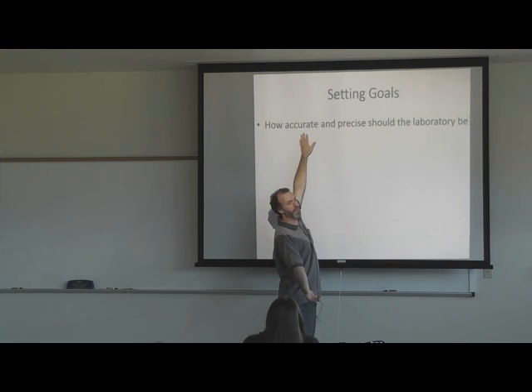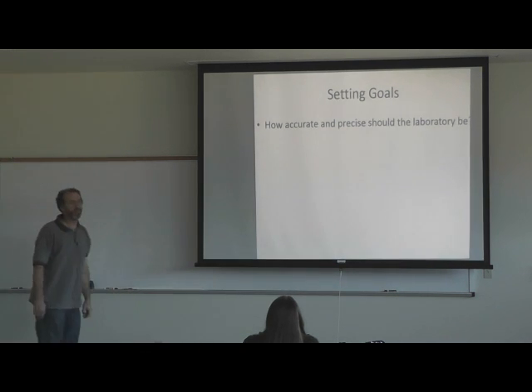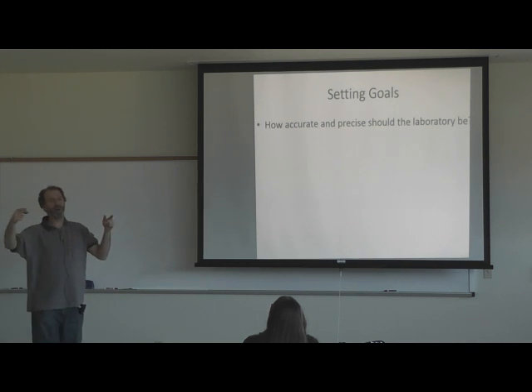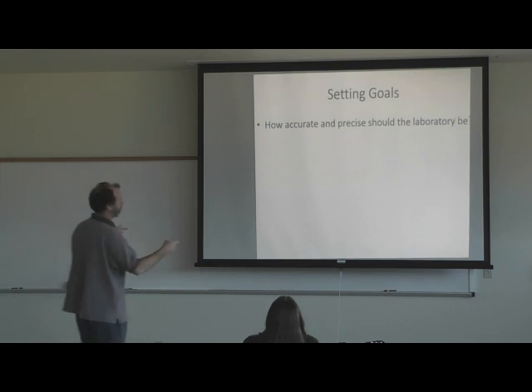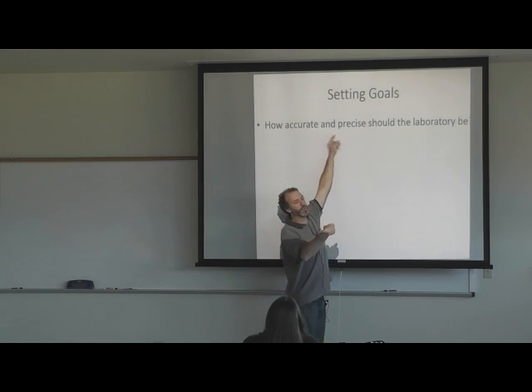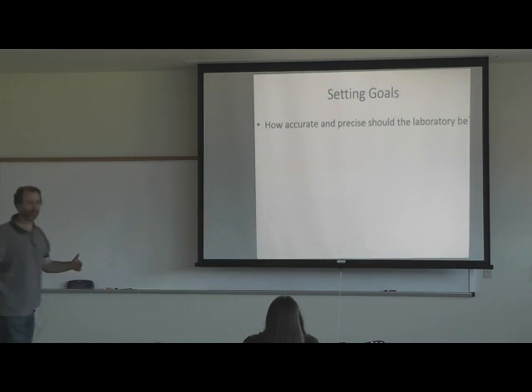What does that tell you, the accuracy? Do you know that word? Yeah, but how far away you're consistently from that target is what? No, standard deviation is the scatter. But how far away your mean is from that is your bias. That's your equipment's bias. So you need to know your equipment's bias, and then your standard deviation, your precision, you add those together, it needs to be below the total allowable error based on that law.